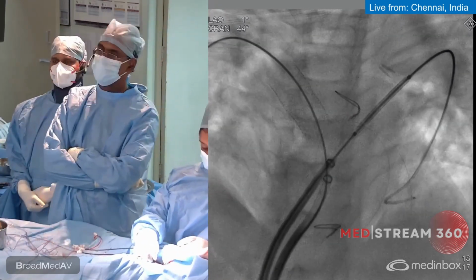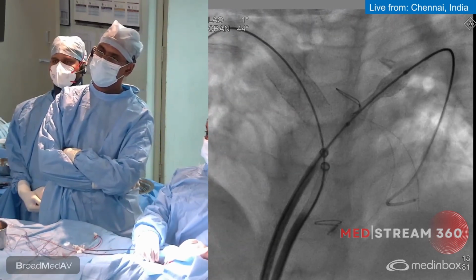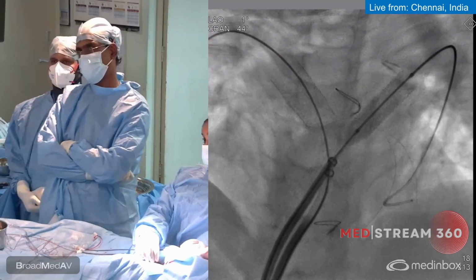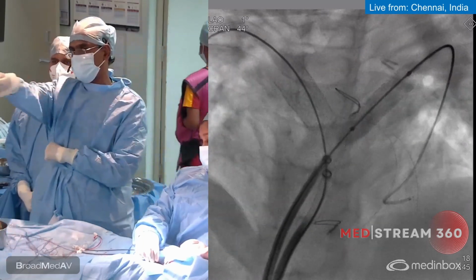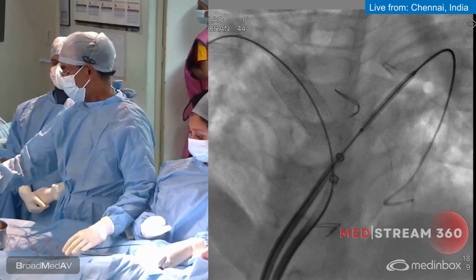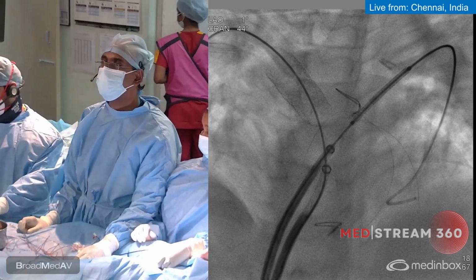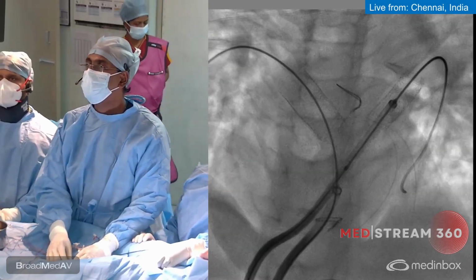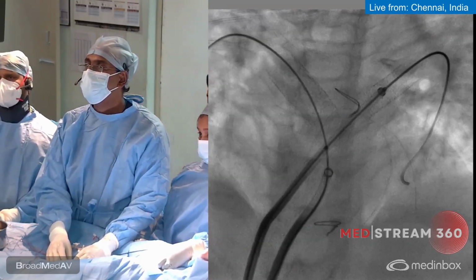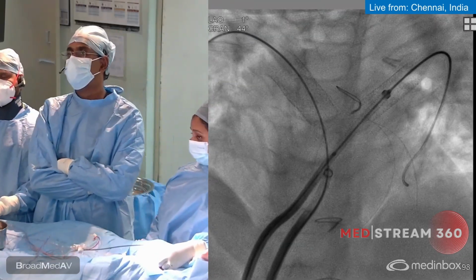Okay. So at this point, the stent is actually flush with the other pulmonary artery. So can you hold the wire? Is this balloon fully negative? Fully negative. Okay. No, it is possibly there only. No, proximally it has moved more distally.